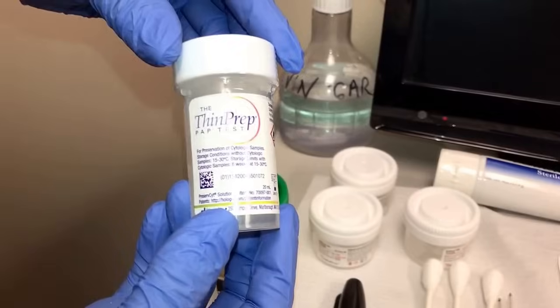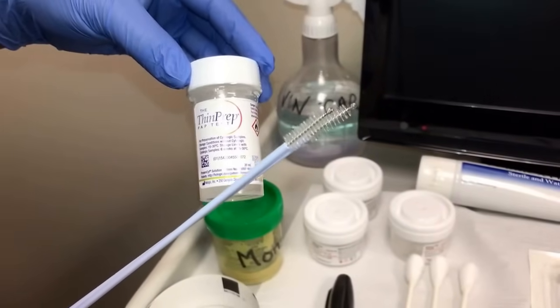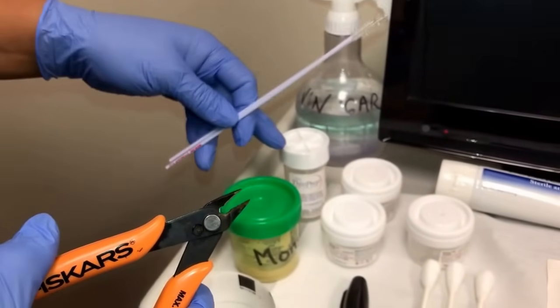This vial here is for the ECC biopsies. Those would be collected on these brushes here, which would then be cut by these wire cutters into this vial.